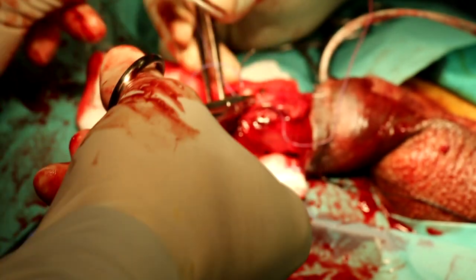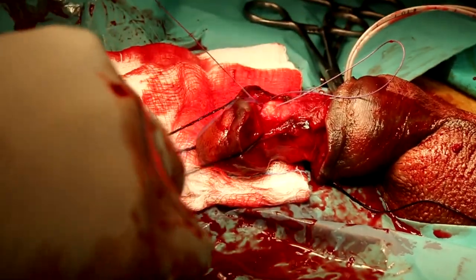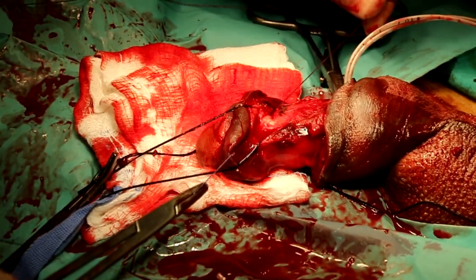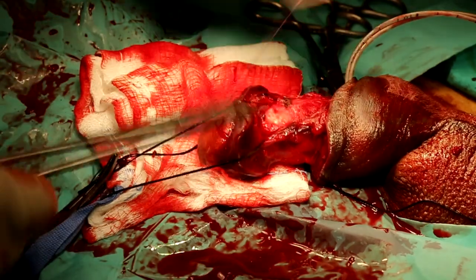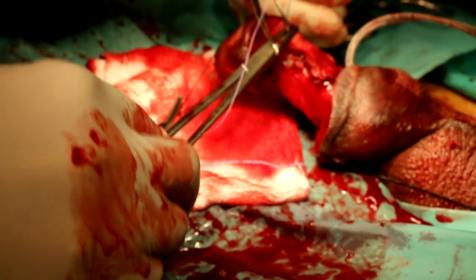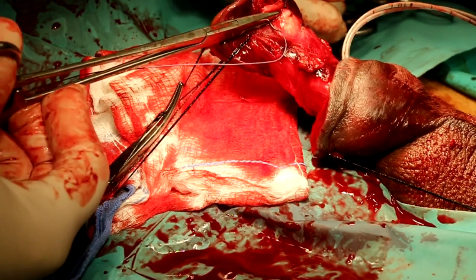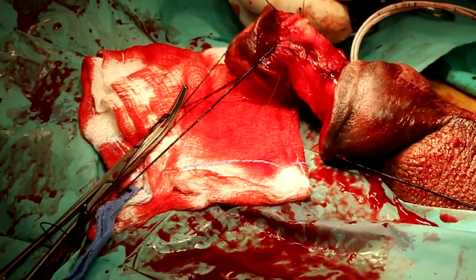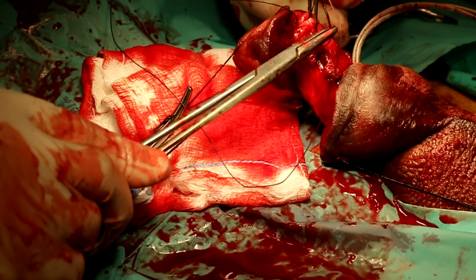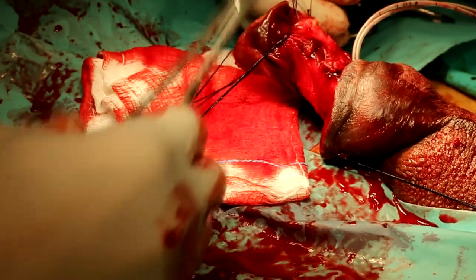So this is the absorbable, as I said, the traditional school uses a non-absorbable. But if you use a non-absorbable, the knots should be buried, and you also have to reinforce the tear with the fascia to make all knots buried. Now people have switched a little bit to absorbable, especially after the invention of more prolonged absorbable sutures like the PDS, which lasts at least 6 weeks. If you use absorbable, you can use interrupted or continuous suture, locked or unlocked, it's up to you.